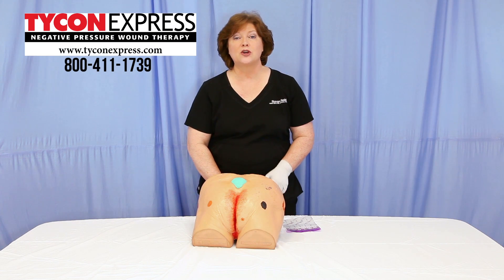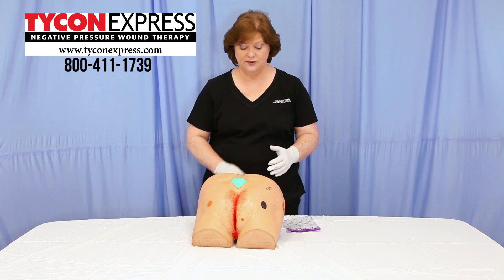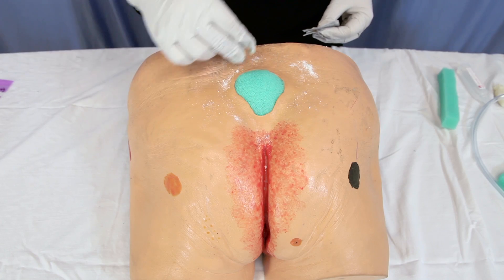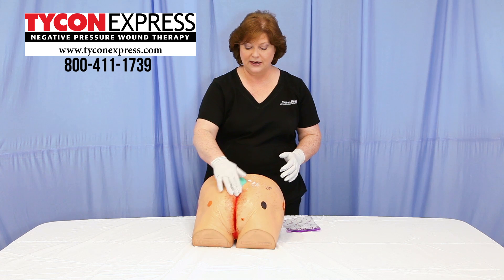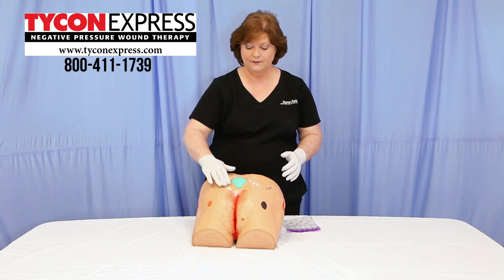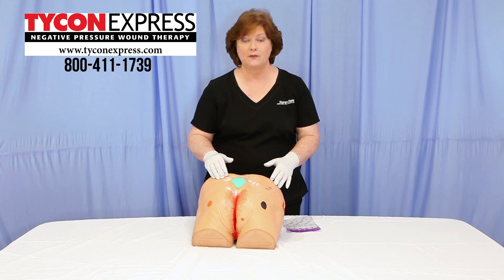Then take some stoma adhesive powder or other types of ostomy powders and apply in a dusting technique, spreading the powder in the surrounding area. Then, in a tapping motion, go over the previously laid skin barrier.